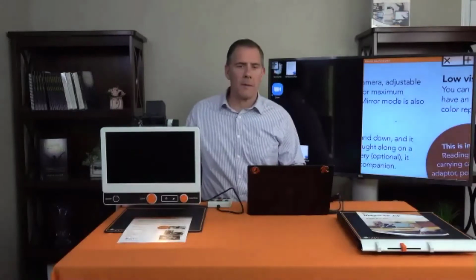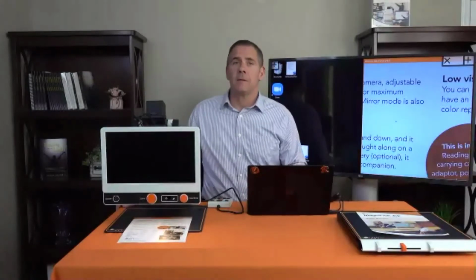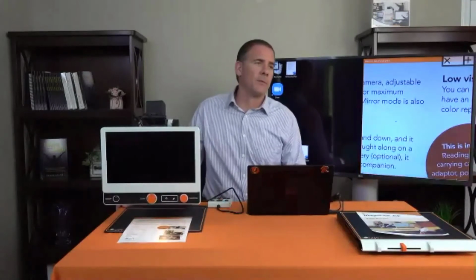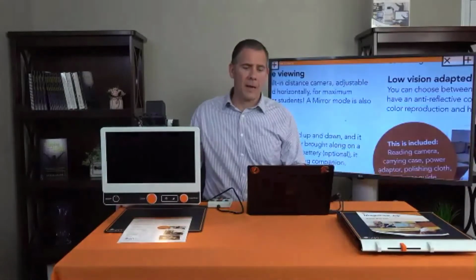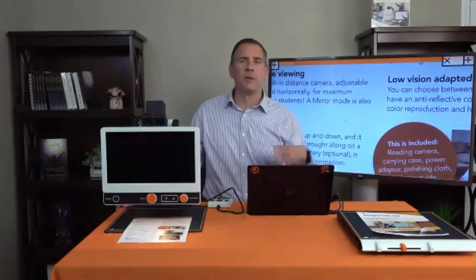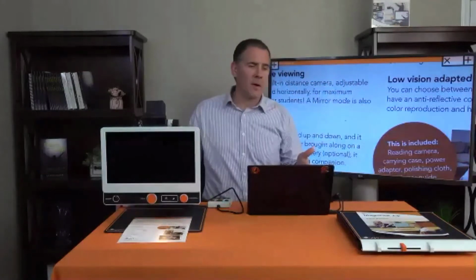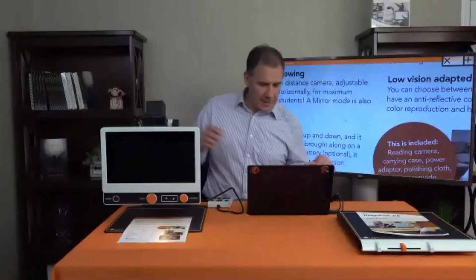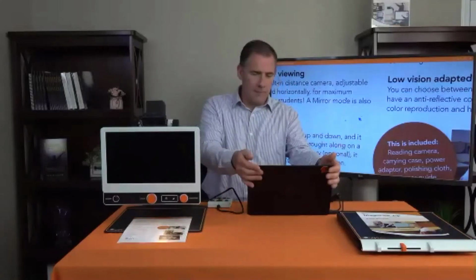I'm hitting F8, and F8 is split screen. So this is cool. If I've got my zip hooked up and I want to jump on my desktop, open a Word document, jump into Google Classroom, or research something on the internet, I can just tap F8 and jump back and forth. Now I have it just doing half the screen like this. You could do a horizontal, vertical. You could have it go through all the different positions. I removed them in the software, so it only goes to the one I like and back to my full screen mode. And I have Windows magnification there. So I'm going to close this and move on.